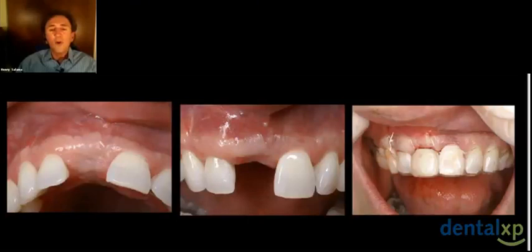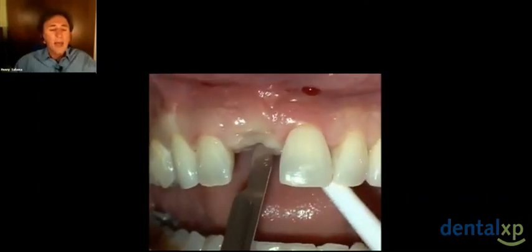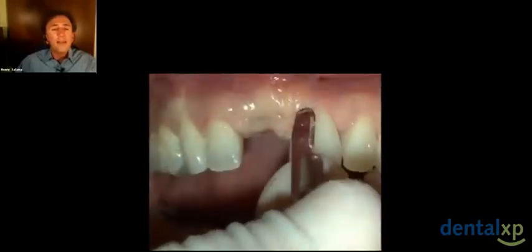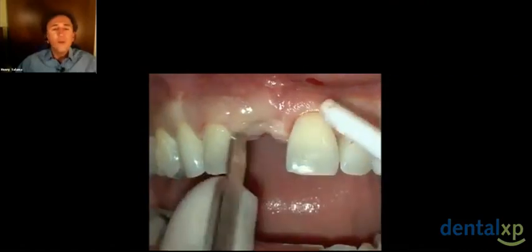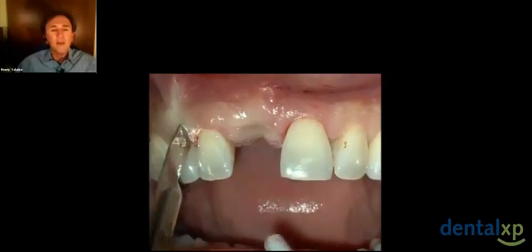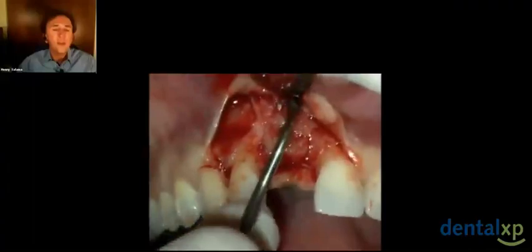This patient went home with an Essex appliance as a temporary, and at 4 months, we're able to go in, and I want to share with you the implant placement and really look at the situation where we can go back in after you've augmented the site. And even though we always try to over-correct areas at every aspect of our augmentation, because our goal is to take it, in this case, a type 2 site, make it into a type 1 site.